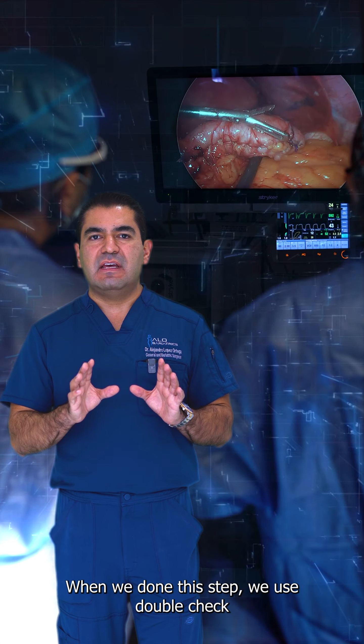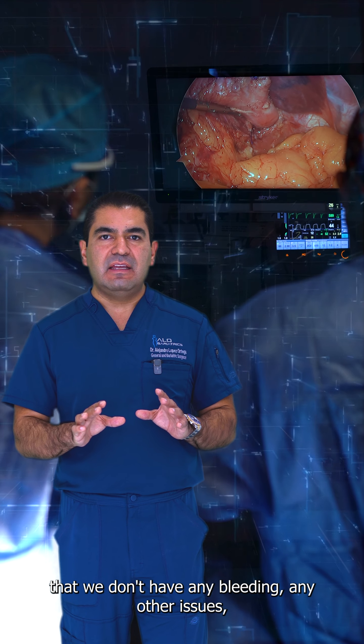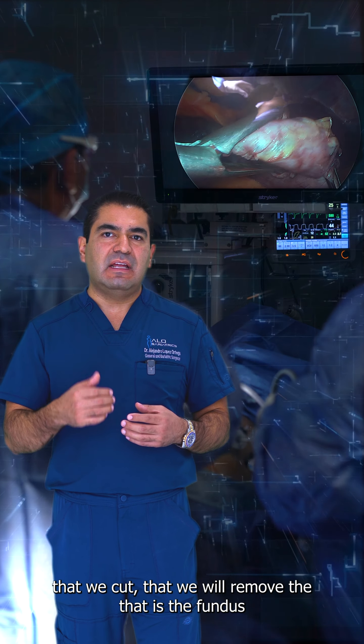When we have done this step, we just double check that we don't have any bleeding or any other issues. And we remove the piece of the stomach that we cut, which is the fundus.